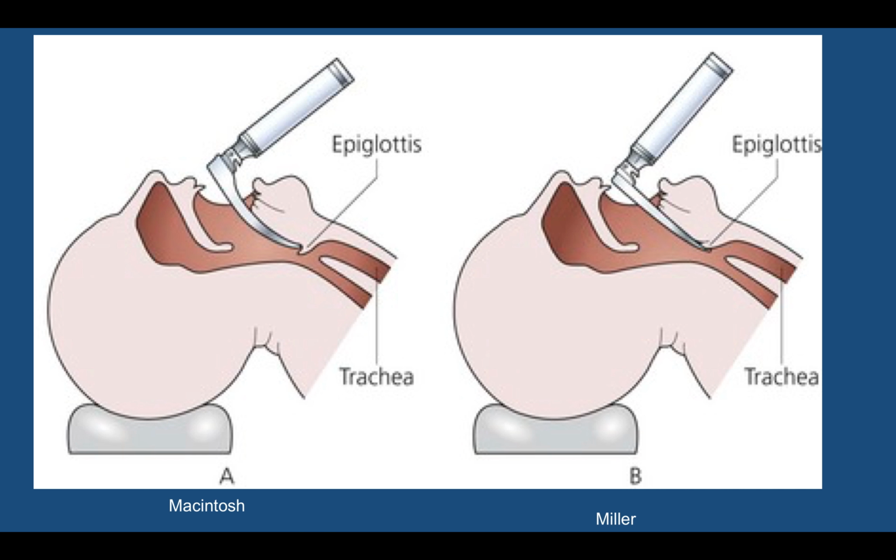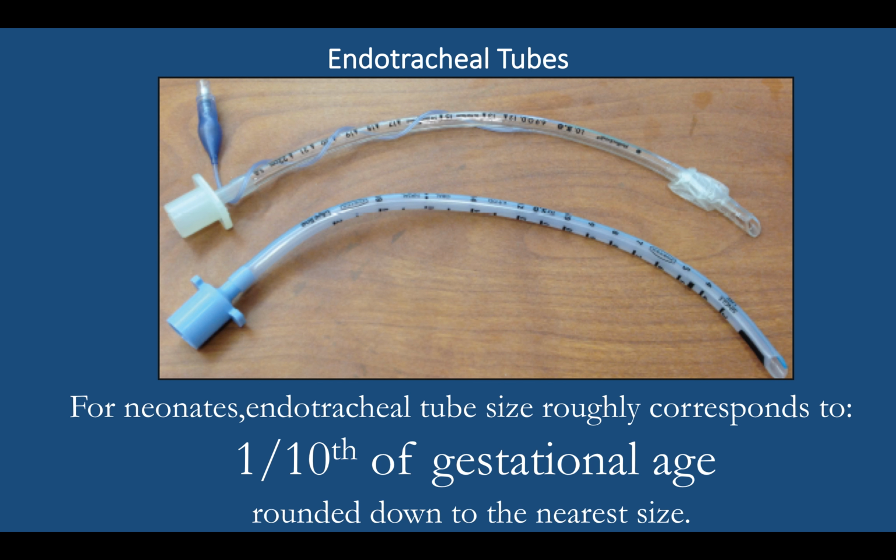These are examples of endotracheal tubes that you may come across. Please note, the one on the top of the image is a cuffed endotracheal tube. We do not use these types of endotracheal tubes in neonatal patients. In the pediatric ICU and the ER, they are the preferred, but not in the neonatal population due to the injury the cuff can cause to the airways.